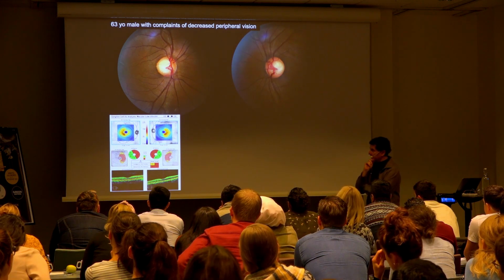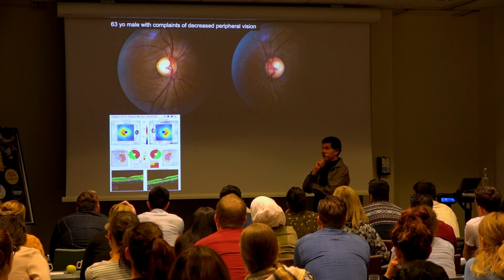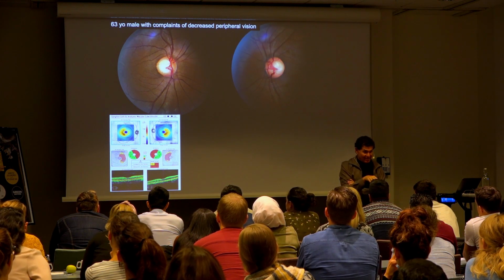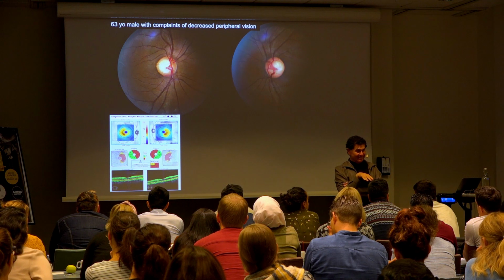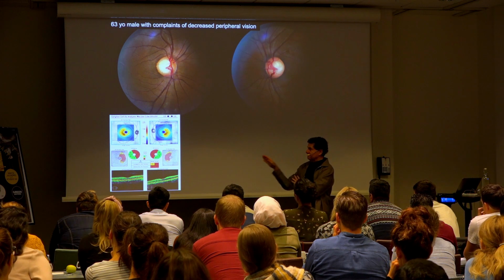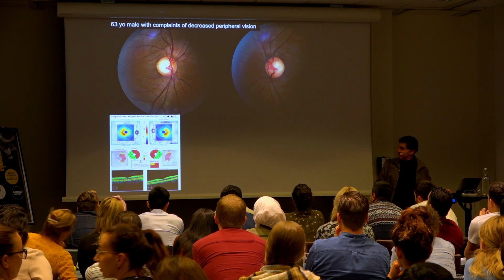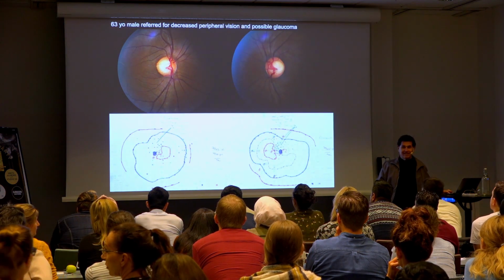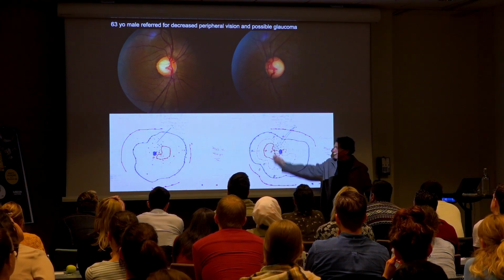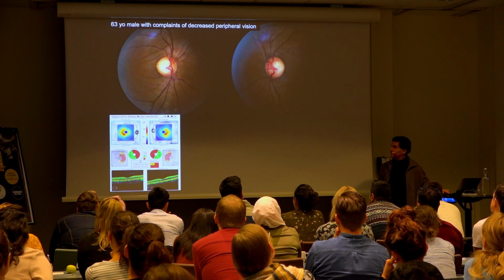Now look at the ganglion cell layer. Bitemporal? Yeah, well, binasal retina and bitemporal field defects. So you're asking the question, which glaucoma patients do you want to image? Obviously not all of them, but ones that are showing this type of pattern. If you go back to the visual field, it doesn't look so arcuate anymore. It's starting to respect the vertical meridian, not so much an arcuate. But that's where the ganglion cell layer can help point you in the right direction.